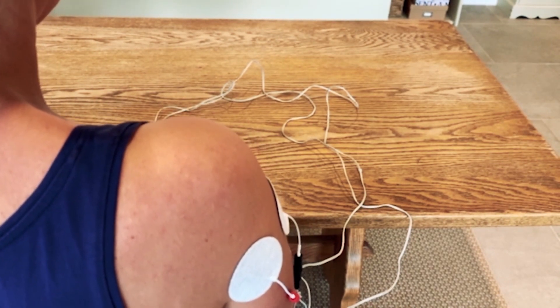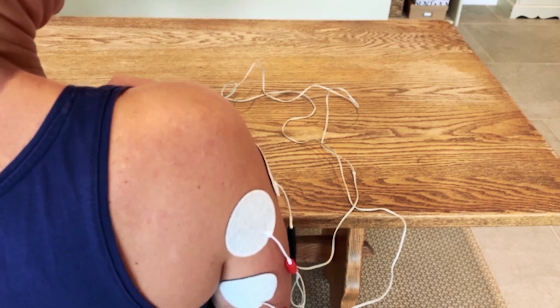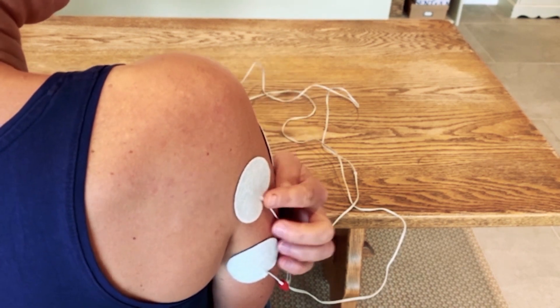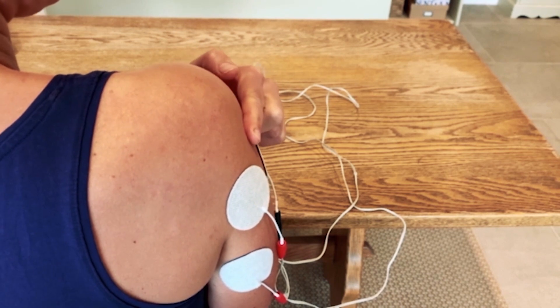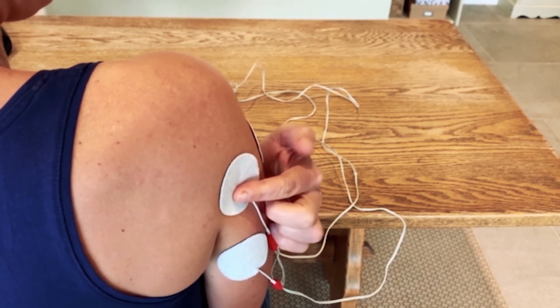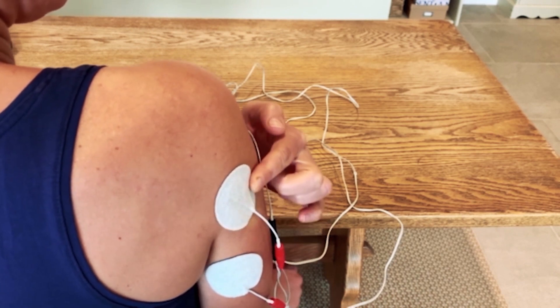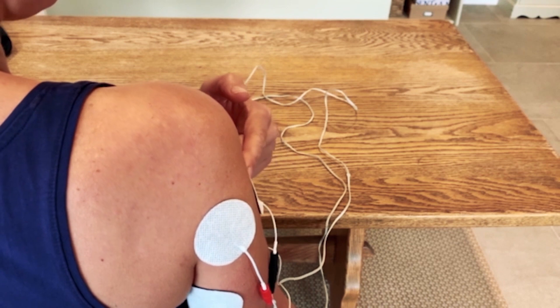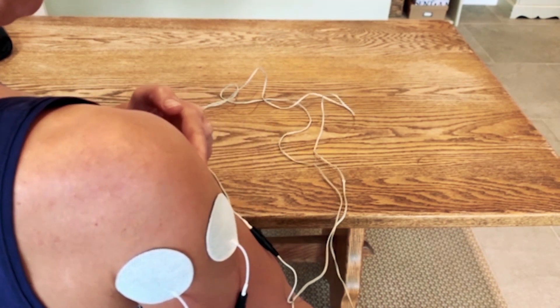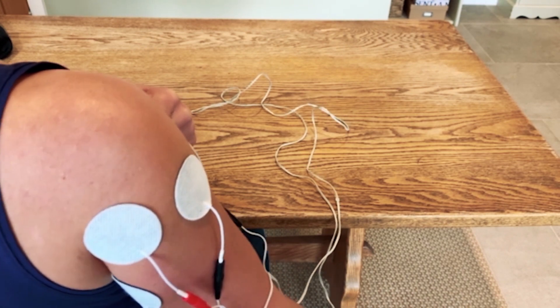Electrode placement for shoulder subluxation. We've got two leads, four electrodes. Starting by finding the gap where the subluxation is — just beneath that gap at the back of the upper arm, we've got one electrode on the posterior deltoid. Then follow that line around the mid of the upper arm, the mid-deltoid, and one electrode right on the front following the same line — the anterior deltoid.